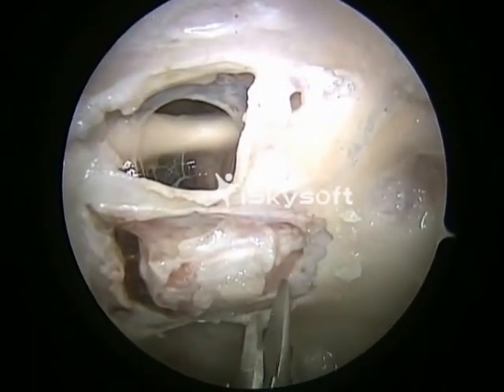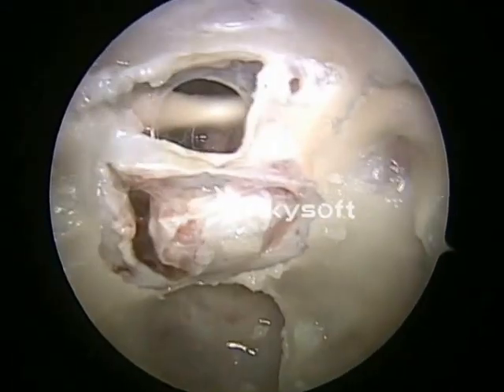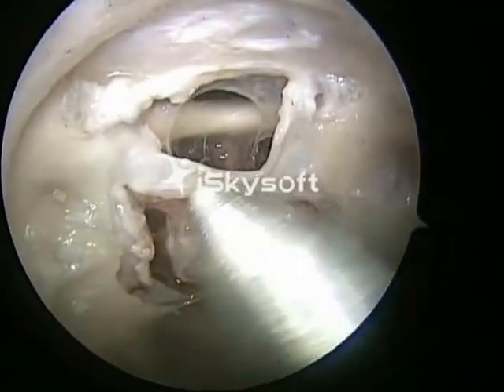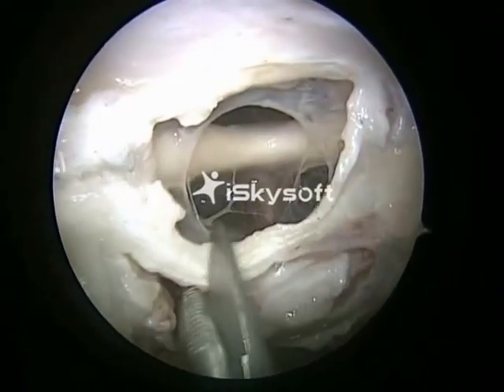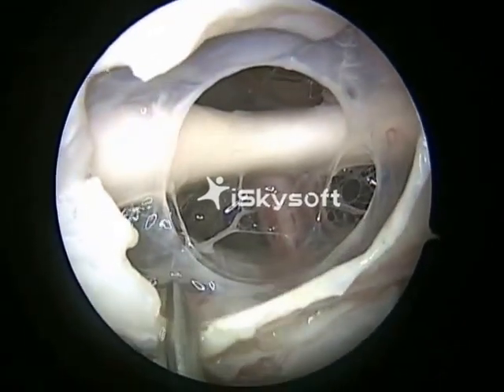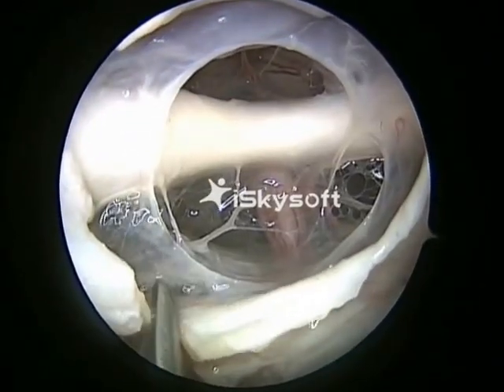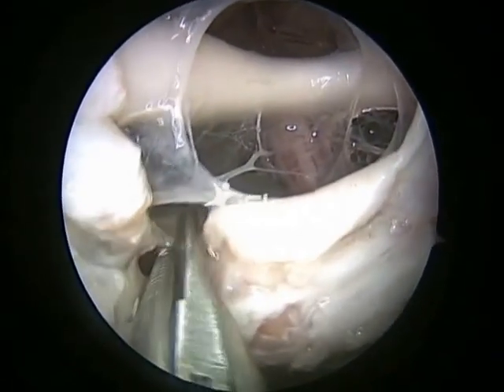You can see how gently it's being done. That is the region of the superior intercavernous sinus. Care is taken not to injure the superior hypophyseal artery. The inferior hypophyseal artery is transected.